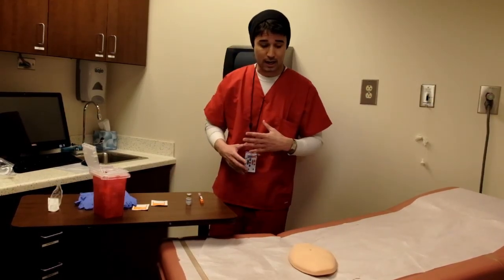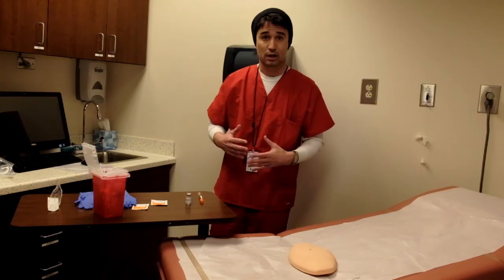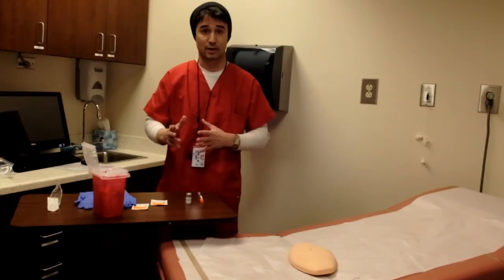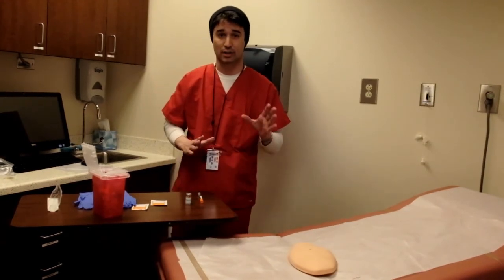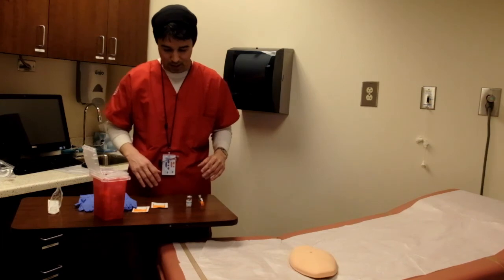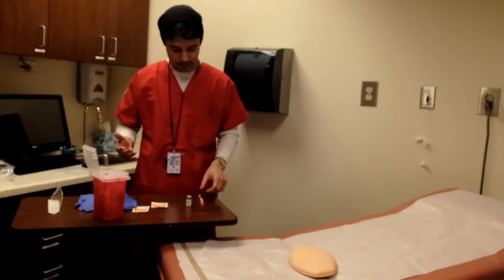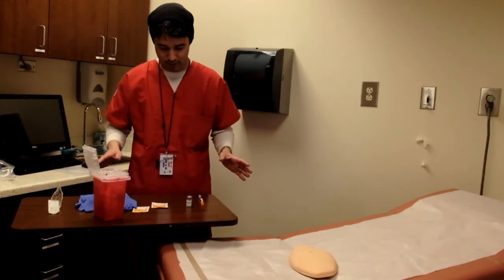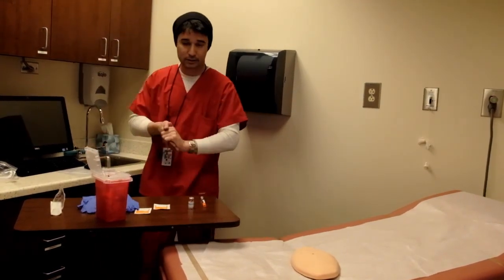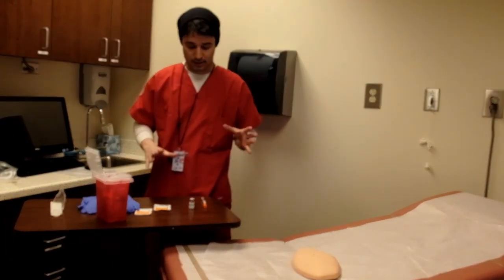I'll go ahead and check my 5 rights when it comes to getting the medication. Sorry, 7 rights, not 5 rights, just to make sure that we're doing everything right. So at this point, let's go ahead and begin. We have our materials here. I'll begin with my hand hygiene. Normally I would wash my hands and then get ready here.